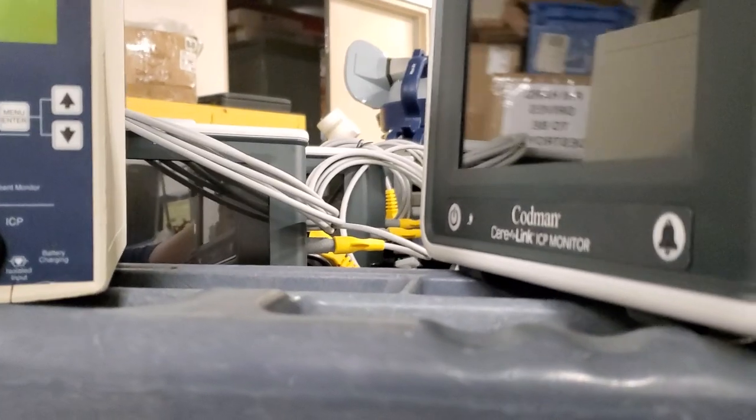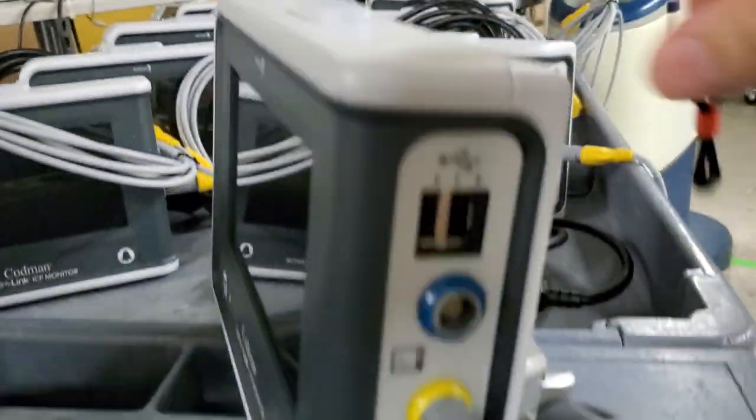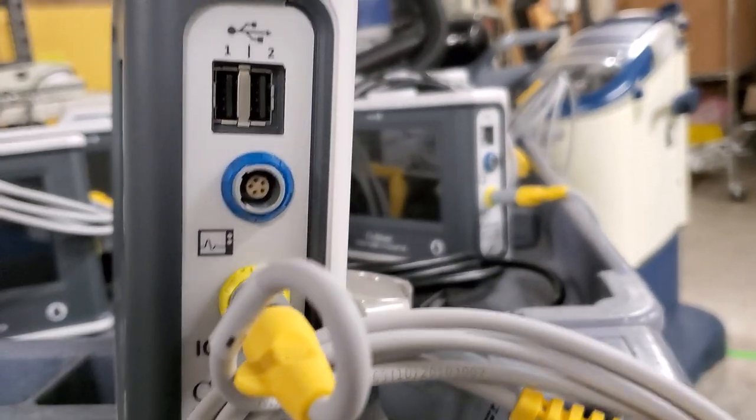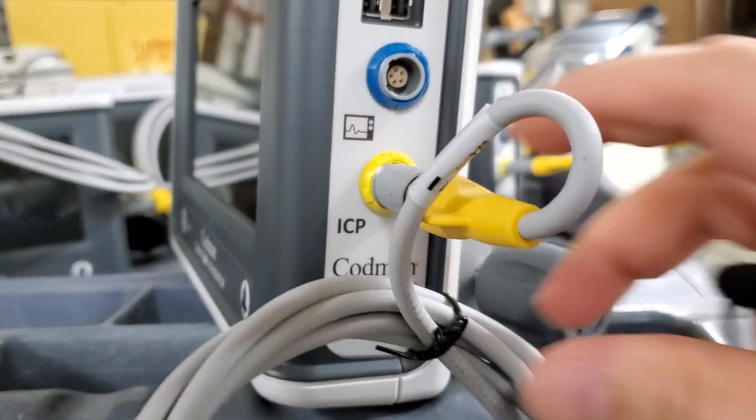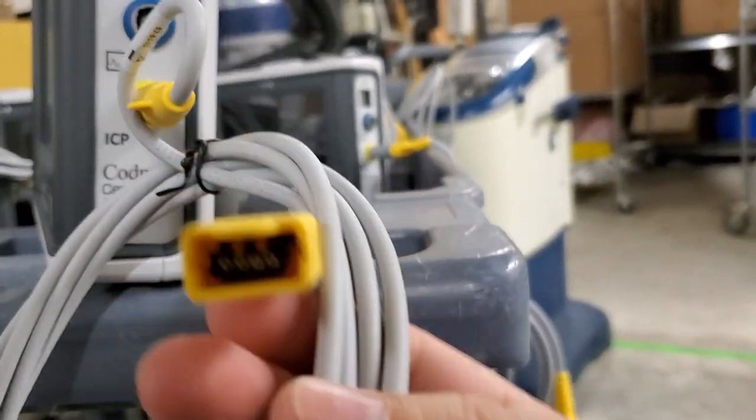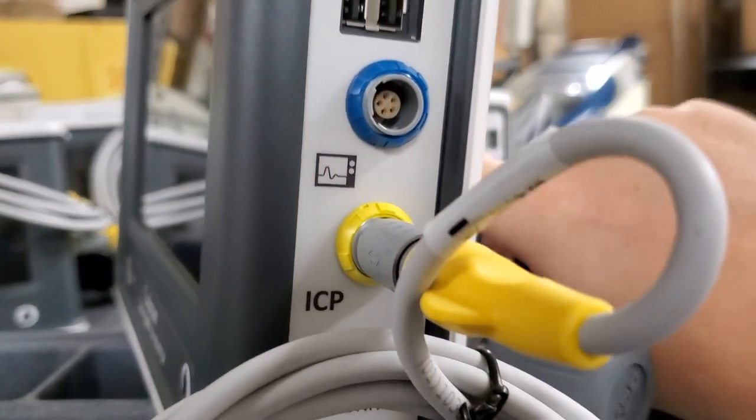But as far as the device itself, it looks like it's got an LED strip at the top that gives you its condition status or the patient condition status. I've got the ICP line right here which runs to your pressure transducer. This one right here, I'm not really sure.